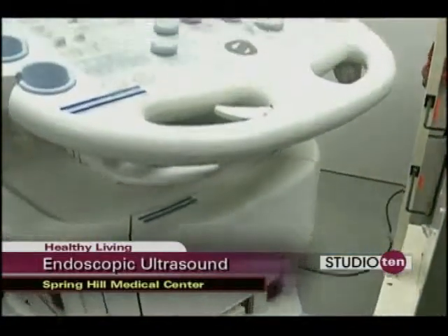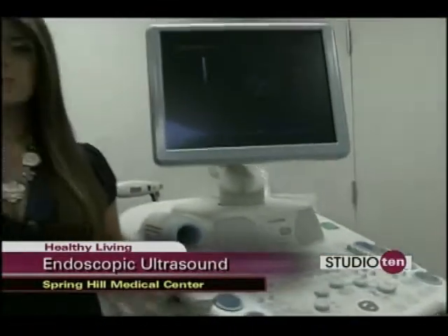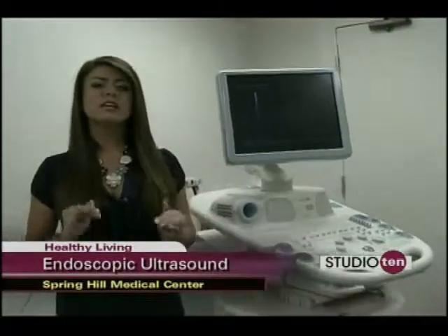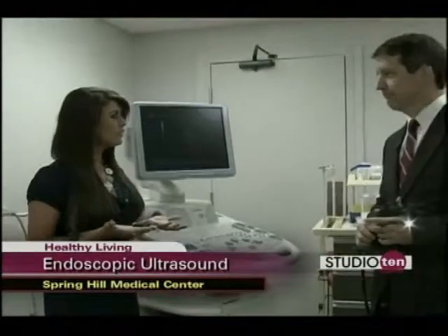This elaborate piece of equipment is the newest type of endoscopic equipment at Spring Hill Medical Center. It's called EUS, or endoscopic ultrasound, and today we're with Dr. Michael Sanders to explain exactly what this does.